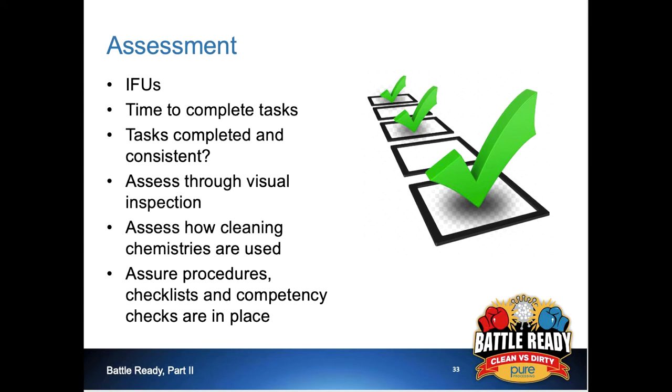of the device. Visual inspection is a powerful educational tool for managers and technicians, and it can help identify poor pre-cleaning practices. A visual inspection should be conducted in the decontamination area and at the prep and pack station, since different discoveries may be made in these two areas.